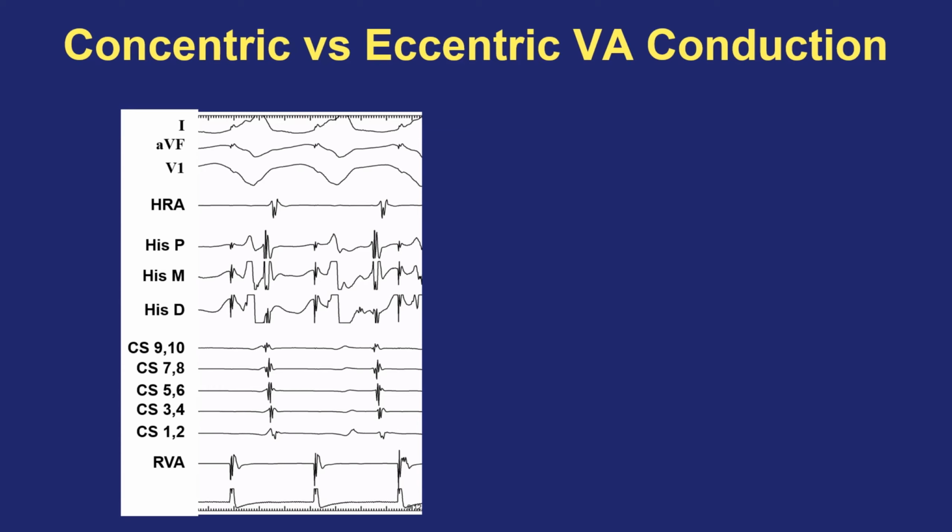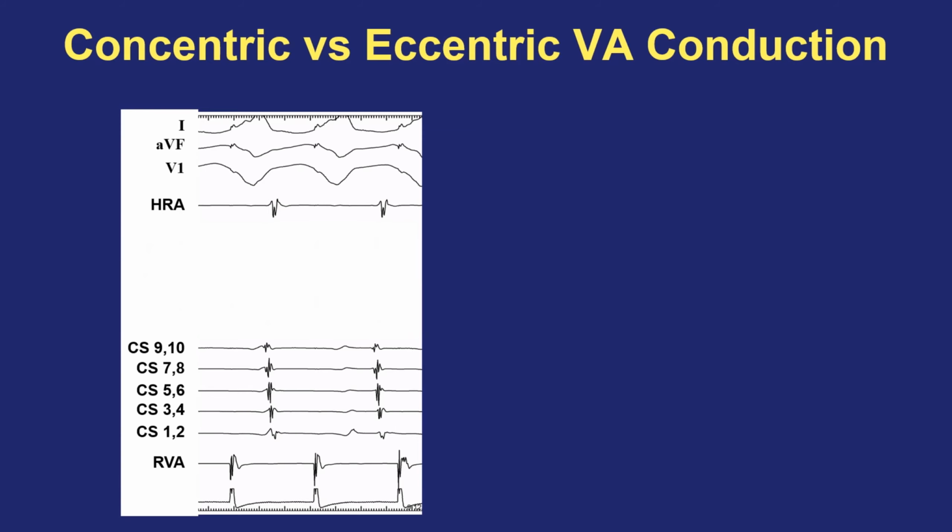So you have to do ventricular pacing in order to detect what's known as a concealed accessory pathway that only conducts upward. This screen initially may look a little bit confusing, and I'm going to eliminate some of the electrogram channels for you because they're not important to the question that I'm asking right now. In the future, as you get more comfortable looking at electrogram screens, you're automatically going to draw your eye toward the electrograms of interest and ignore the ones that aren't important for the question you're asking at that moment. There's ventricular pacing occurring in this image, reflected on the surface with little pacing artifacts before each wide QRS, and also there's a channel at the bottom that shows us that pacing is occurring.